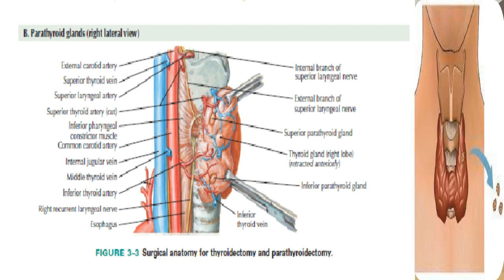Anteromedial traction is applied to the lobe of the thyroid gland and the middle thyroid vein is divided. The areolar tissue between the thyroid gland and the common carotid artery is separated using a combination of blunt and sharp dissection, allowing for further anteromedial mobilization. The superior thyroid artery and veins are exposed by applying caudal and lateral traction to the thyroid parenchyma at the superior pole, facilitating individual ligation of the superior pole vessels close to the thyroid gland, staying lateral to avoid injury to the external branch of the superior laryngeal nerve (EBSLN).